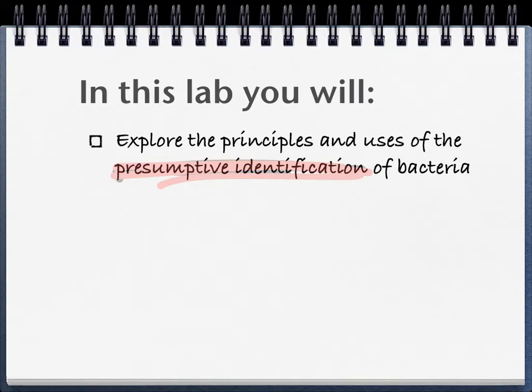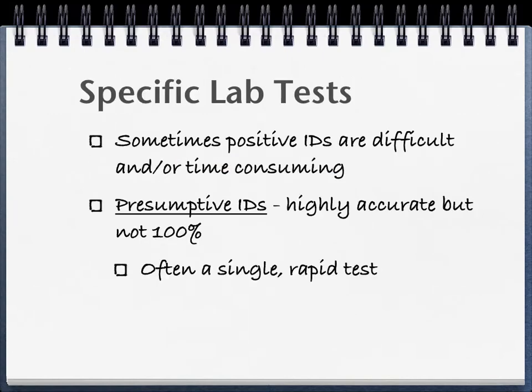How do we get the nitty-gritty? We talked about that as well. Fingerprinting, right? Our biochemical fingerprint, right? Remember all those different biochemical tests, right? That's the traditional way of identifying microbes, right? Now, it turns out that doing that is actually difficult. It's time-consuming, right? Minimum, how long before we get a biochemical test back? How long? 30 minutes. Not 30 minutes.